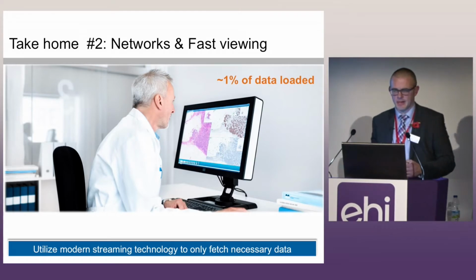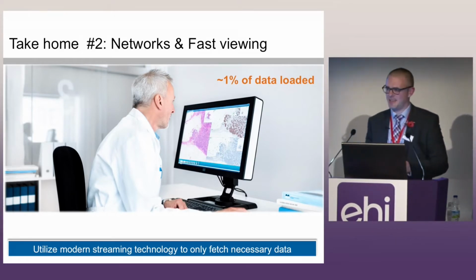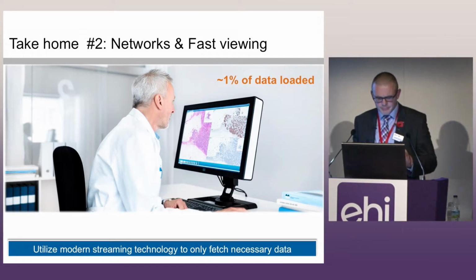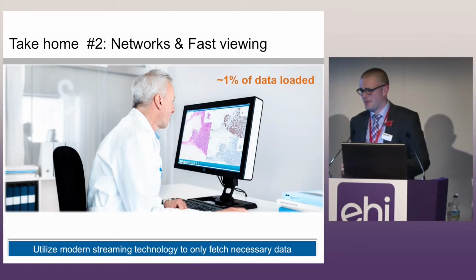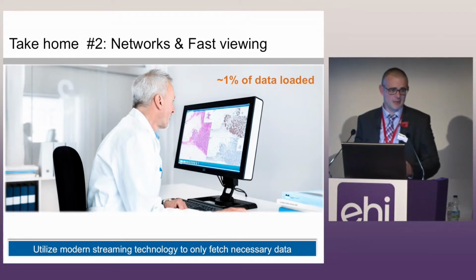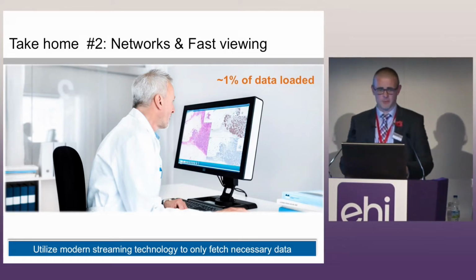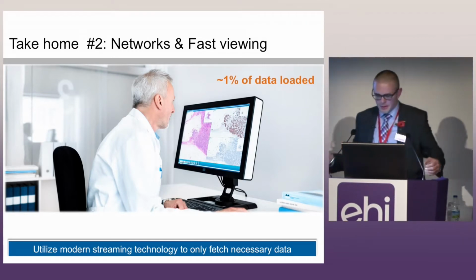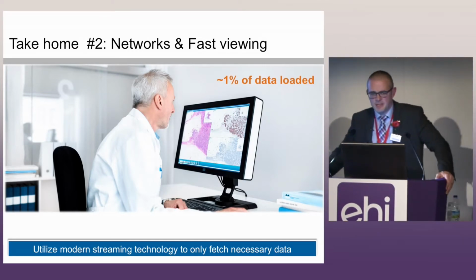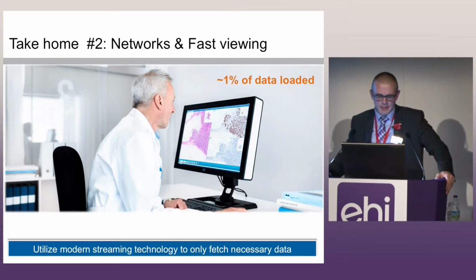Networks and fast viewing. I guess the IT guys in the room will be extremely worried about the thought of 50 gigabyte files being passed around their networks on a day-to-day basis, from workstation to MDT meeting, etc. Again, this is where medical imaging heritage really comes into play.